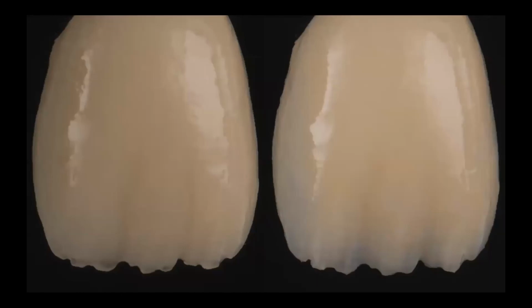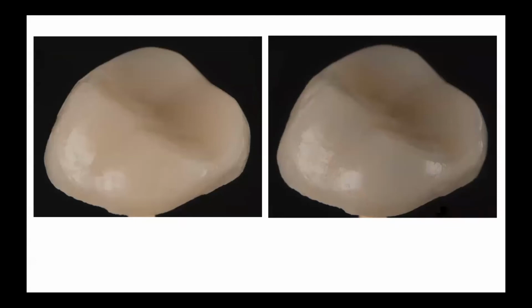So the second way is to choose a lighter ingot for pressing of this framework, and after that to provide the previous staining with the help of body stains. This way we can achieve the final color and provide the distribution of our value. At the same time, there's an opportunity to individualize the enamel area and to emphasize mamelons with some bright stain. When we use this solution, we can use more translucent enamels to create the enamel area and apply them with a thinner layer. And the same technique we can use when we make crowns for molars, for example.